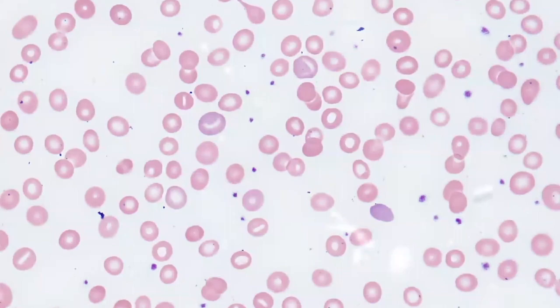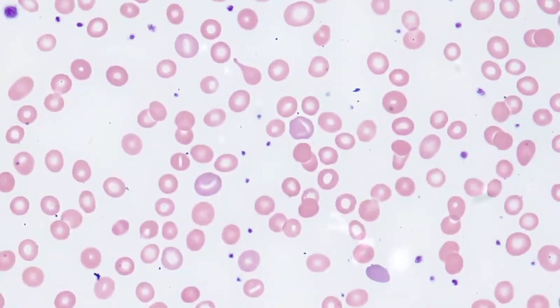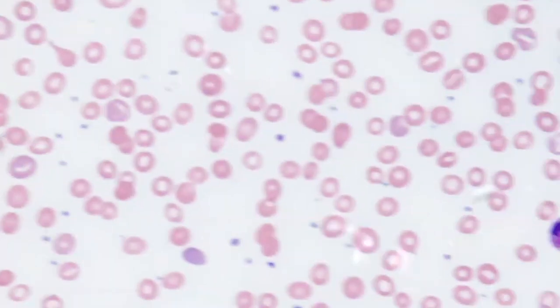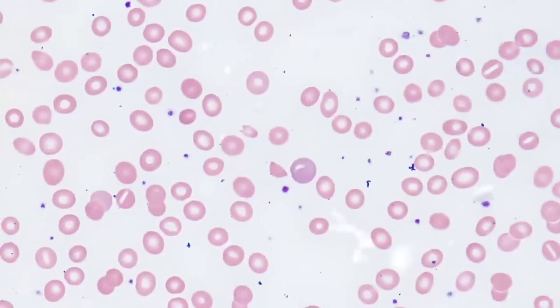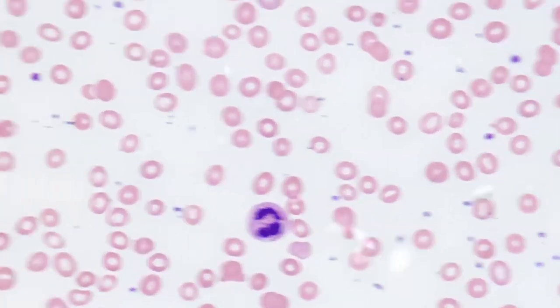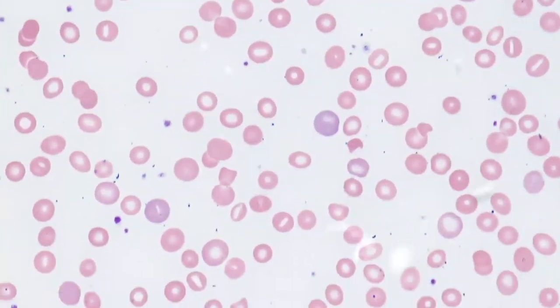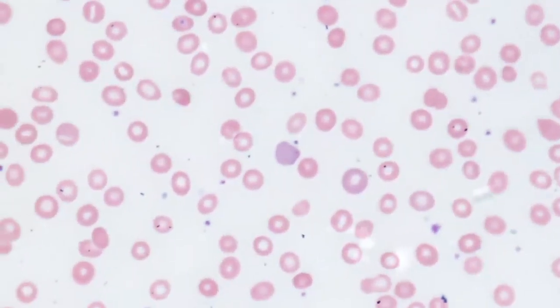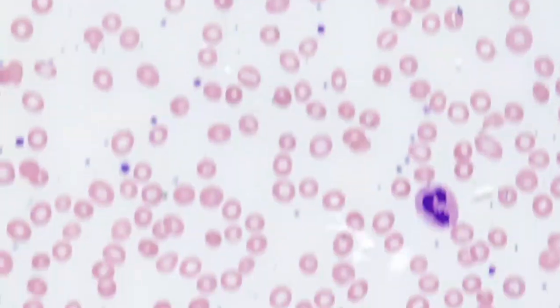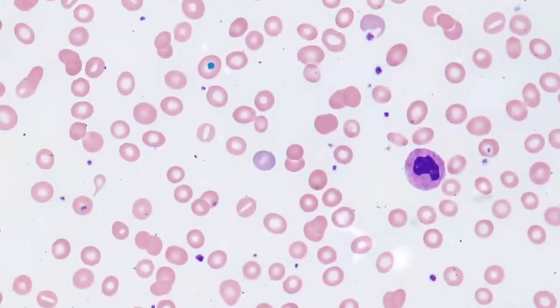And importantly, they show these reticulocytes. These are those purplish, less eosinophilic red cells that we can see scattered all around in this peripheral blood smear. That's a sign of red cell regeneration. These are earlier red cells just coming out of the bone marrow, and this is a sign that the patient is trying to regenerate their red cells.